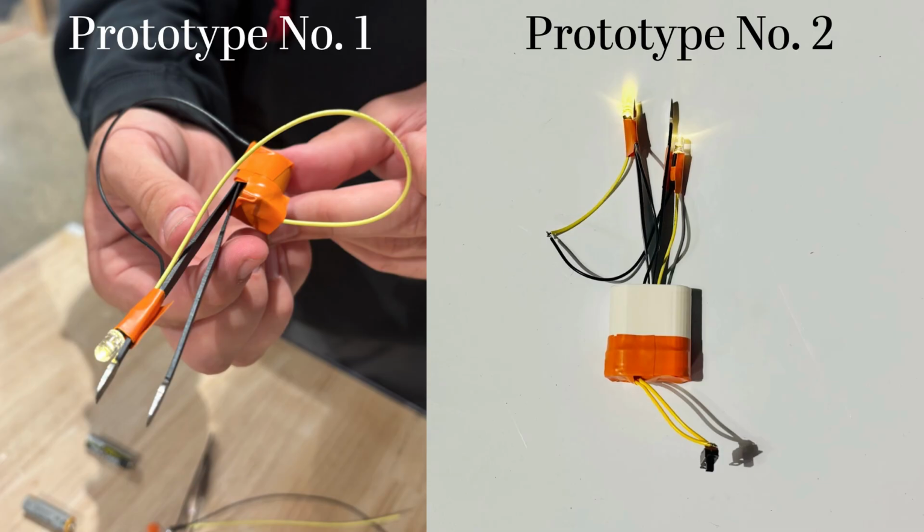We progressed with this design, creating our second prototype, which had LEDs on both prongs, a casing for the two AAA batteries, and a switch for the LEDs. This design didn't fully satisfy our ease of use criteria. The two AAA batteries made the design bulky and at times difficult to use. Additionally, the LEDs were large, making it difficult for the forceps to reach into smaller cavities.